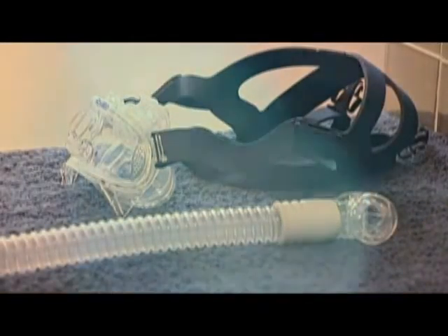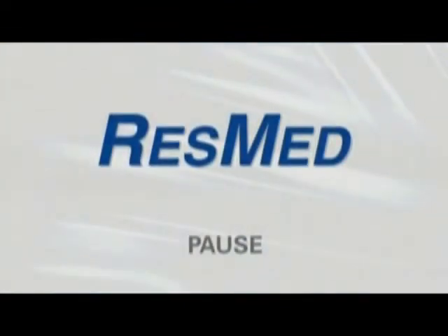Now it's your turn. Pause the video here and practice reassembling the Mirage Liberty.